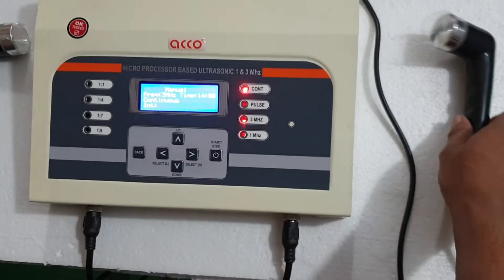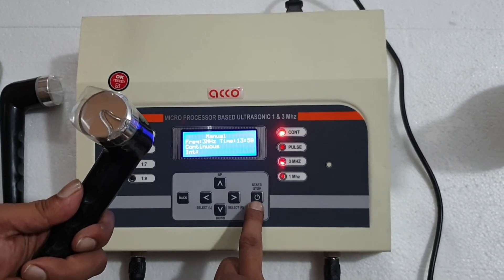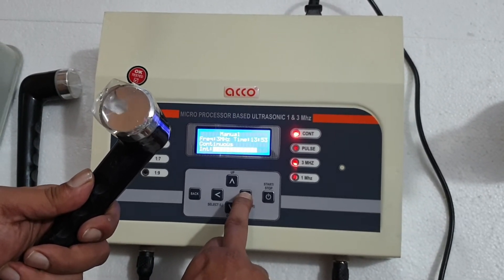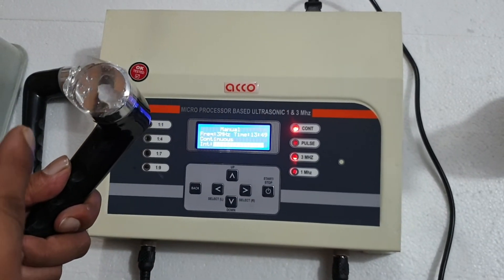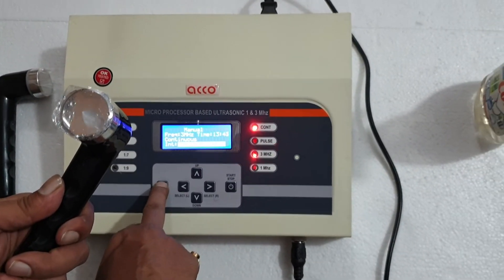Now we will also do a water test on this. Press start and increase the intensity. It means the machine is working on 3 megahertz. To stop, you can press back.